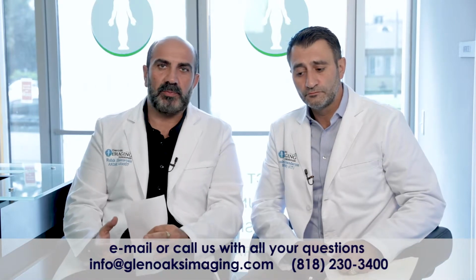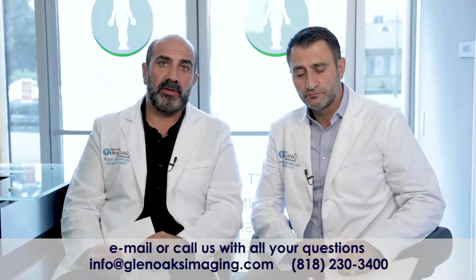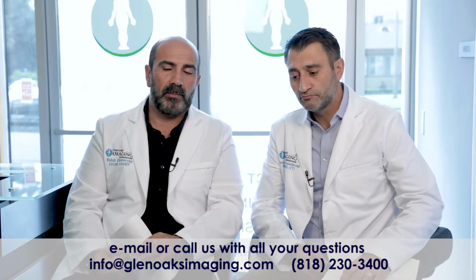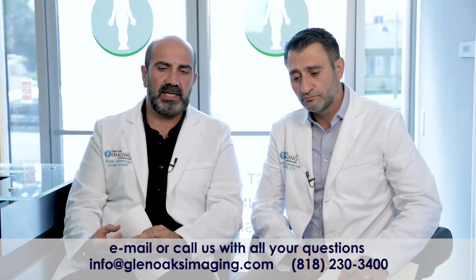Now, why do we do an MRA? What's the reason? Why do doctors order it? Sure. There's a handful of people that can have this kind of MRA procedure done. For instance, we do brain MRA, which is COW, C-O-W, Circle of Willis. It has multiple names. We do it when we suspect a brain aneurysm, which means dilation of the vessels that can cause a major problem. With MRA, it's very easily diagnosed and very easily treated.